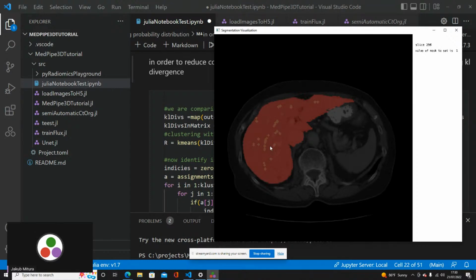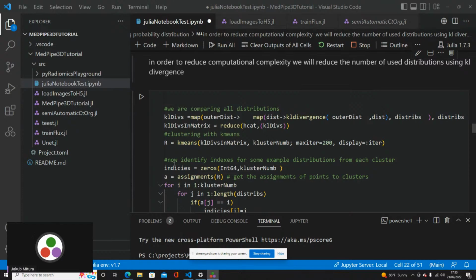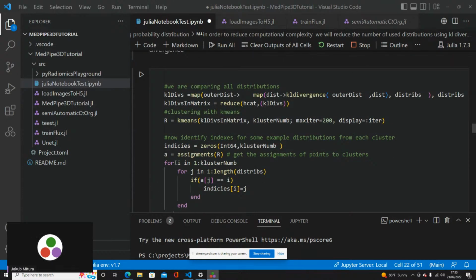Those Gaussian distributions give us the probability of whether a given point is similar to the liver or not. Around each point we create a different Gaussian probability distribution, each defined to show the probability that this point belongs to the liver. But we have hundreds of them for now.